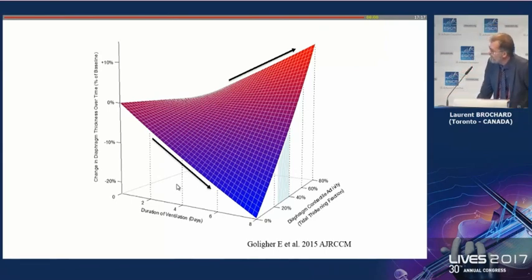But then another important factor was the diaphragm contractile activity. And remember, we can assess this contractile activity by looking at the thickening fraction. When the thickening fraction was very low, let's say below 20%, this increased the occurrence of atrophy.